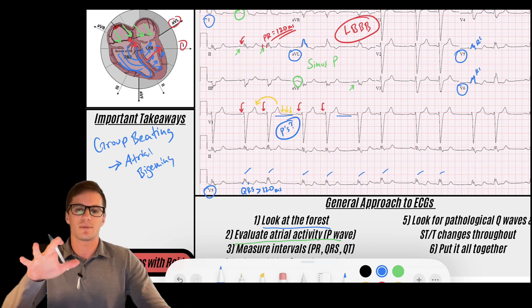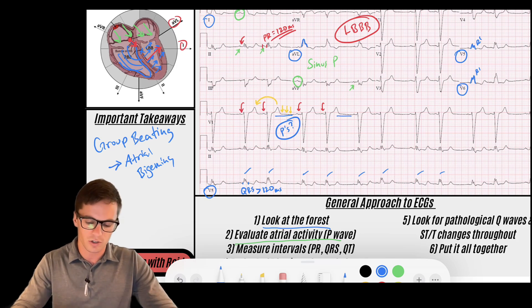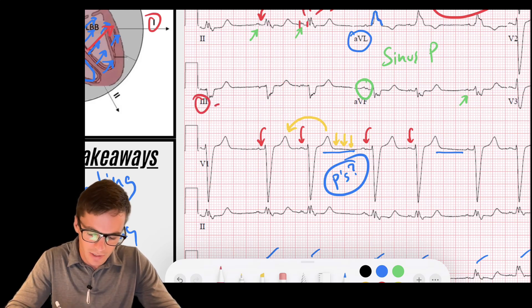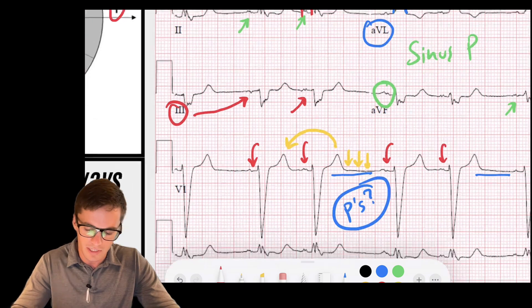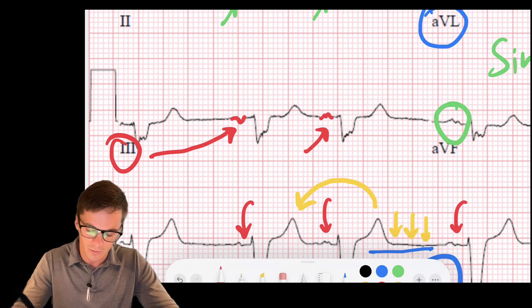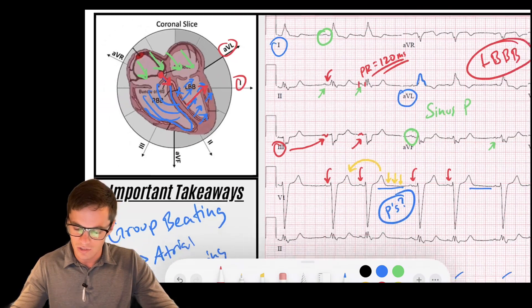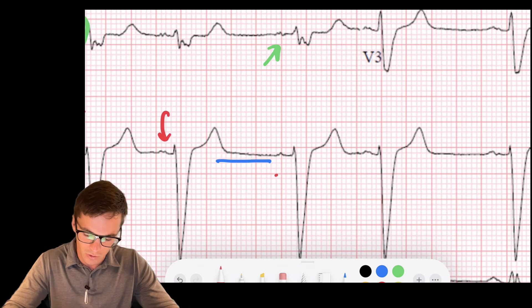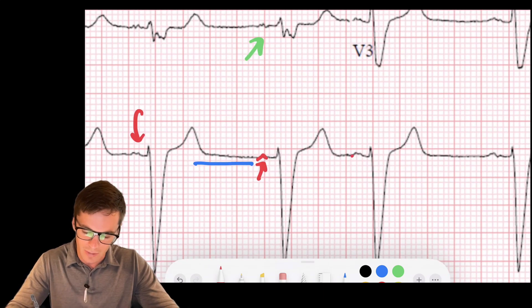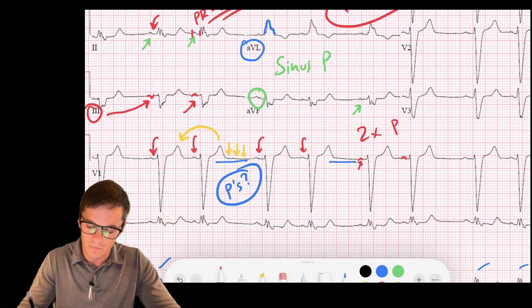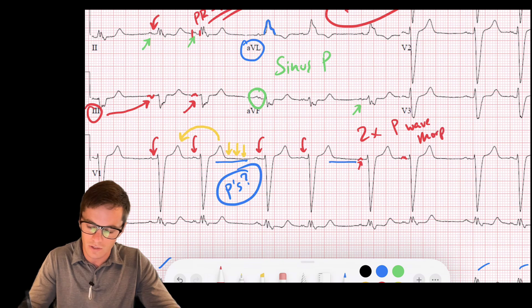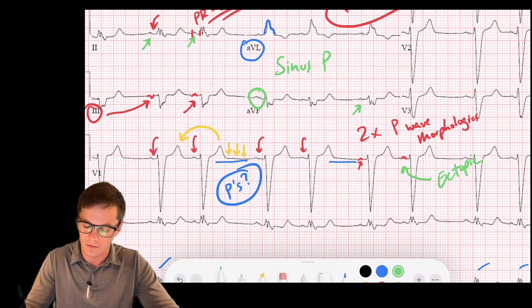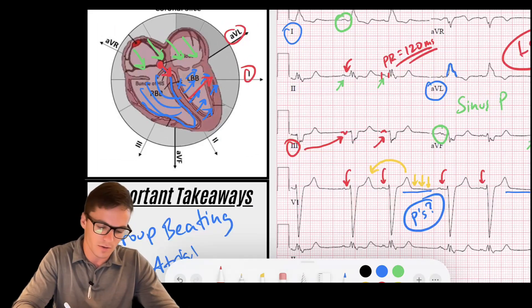Atrial bigeminy means that there's a premature atrial contraction that happens after every other beat. I look closely at my P wave morphologies, maybe I look up here in lead three. You notice that my first P wave looks like so and the next P wave looks a little bit different. This P wave is a negative deflecting P wave, this one kind of has an upward deflecting P wave, so those are certainly two different morphologies. Let's look at maybe lead V1 right here. You can notice it's very subtle but you have this small spiky P wave and then you kind of have this bifid P wave. So this tells me that there are two P wave morphologies - they're very similar but I would say that this one is likely ectopic.